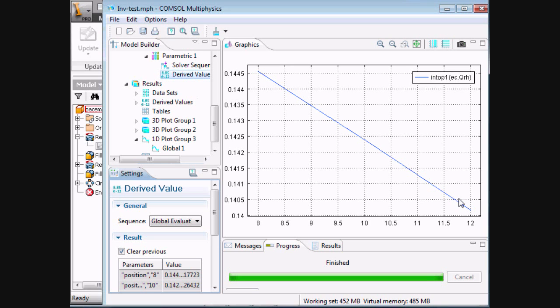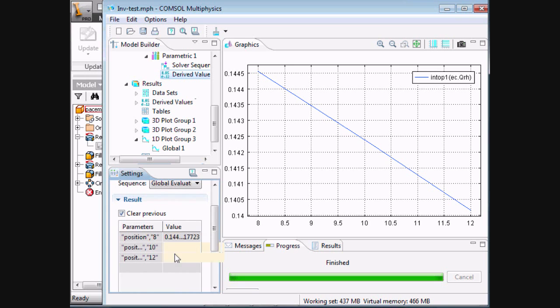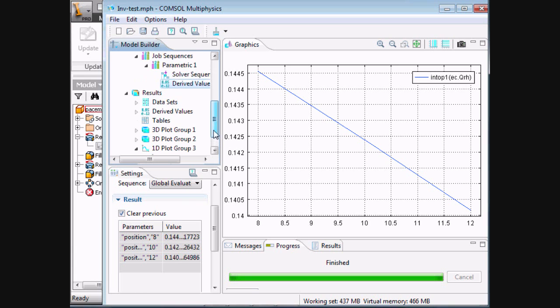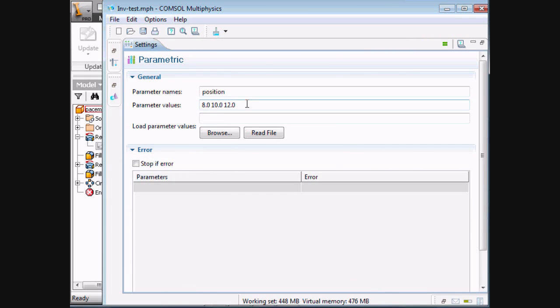There you see the plot for the 8, 10, and 12 and the various resistive values. And here in the derived value node, we can see the exact values that were calculated. Now let me expand on this by changing the parametric sweep values to not just be three discrete values, but let's set up a range. Let's do a range from 6 to 12 at increments of 0.25.